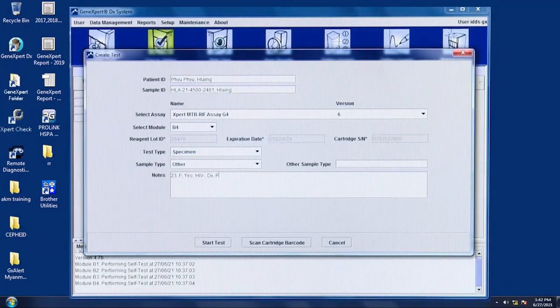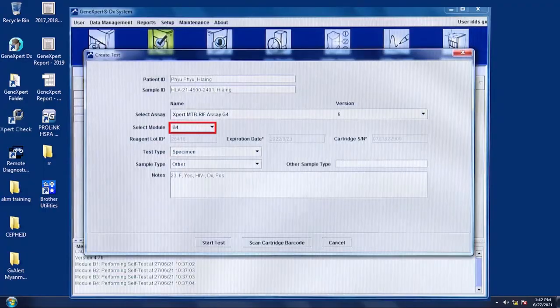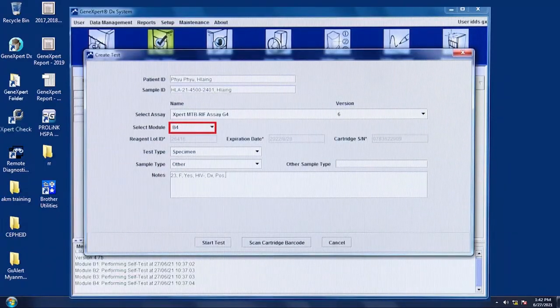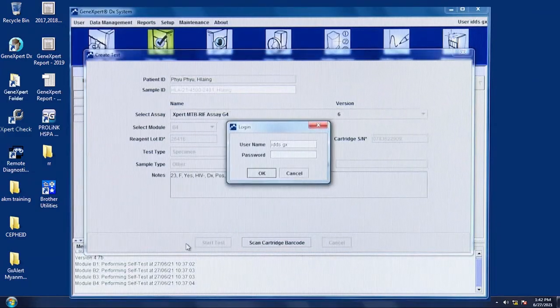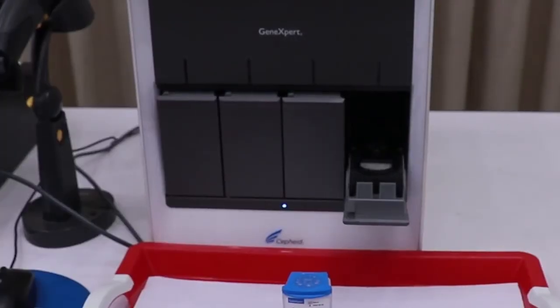However, the sample ID, patient ID, and note fields on the form must be entered according to its format as demonstrated. Click Start Test. The system automatically chooses any available module for loading, and you shouldn't change it.